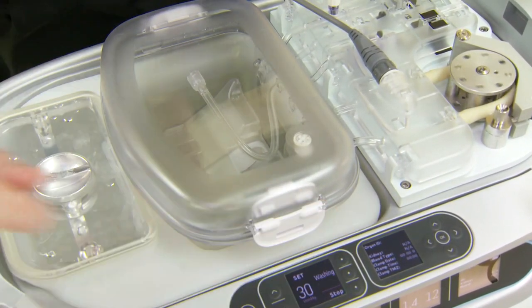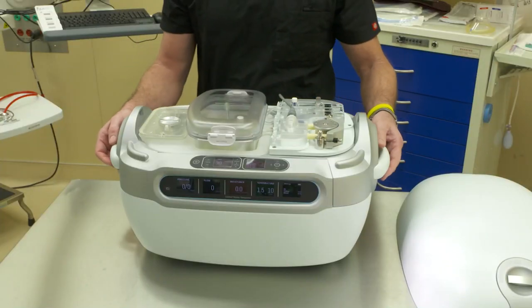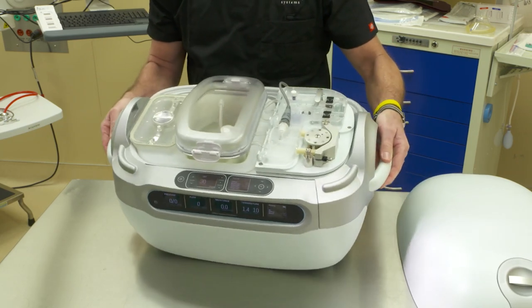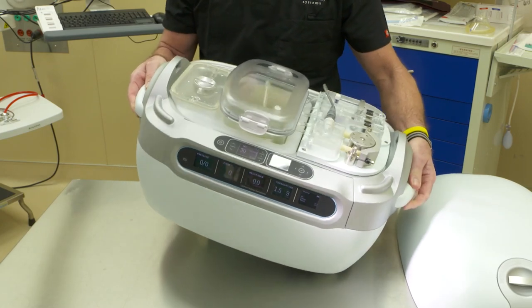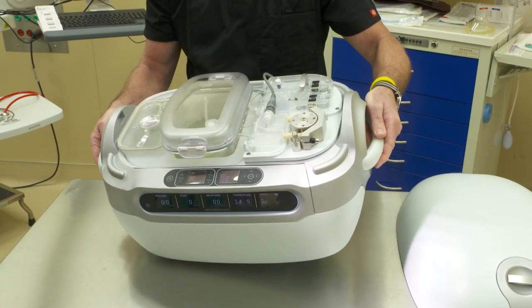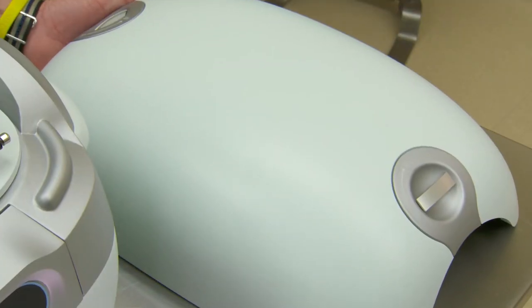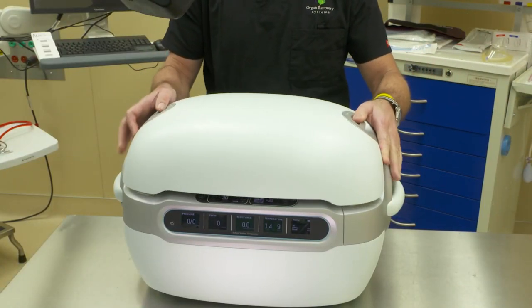Place the unit in wash mode to start the fluid flow into the perfusion circuit. Once the bubble trap is filled with solution and solution starts to come from the wash port back into the reservoir, using a slow 45 degree rotation, rotate the Lifeport unit to expel any ancillary air that may be in the micron filter. Upon completion, replace the outer insulated cover on the Lifeport unit to help with ice longevity.